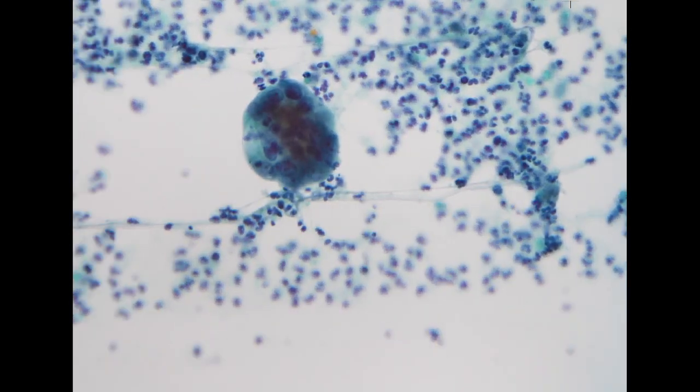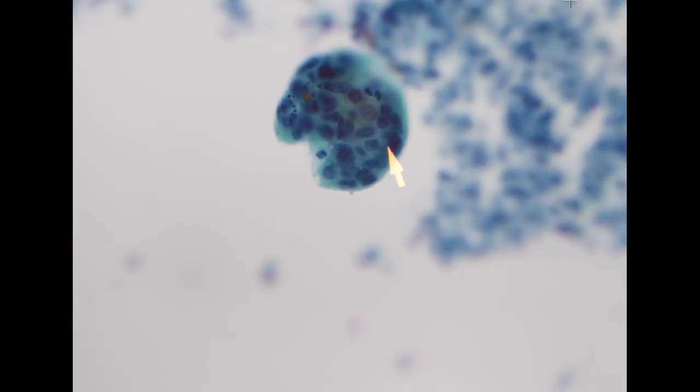And because the patient is under treatment, within this cluster there are some necrosis-type, karyorrhexis-type patterns because the patient is currently under treatment. This is positive for adenocarcinoma.